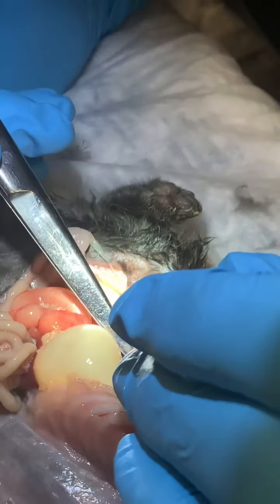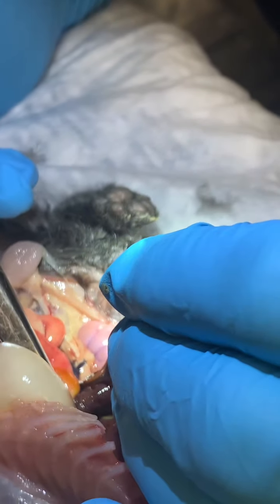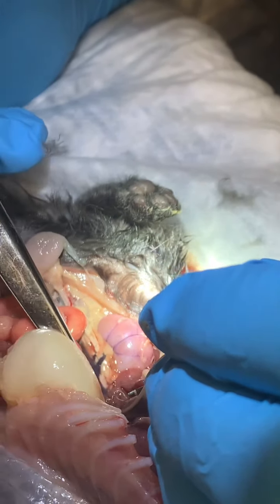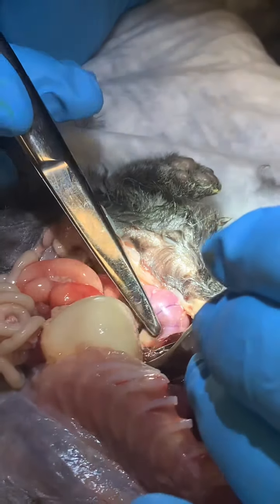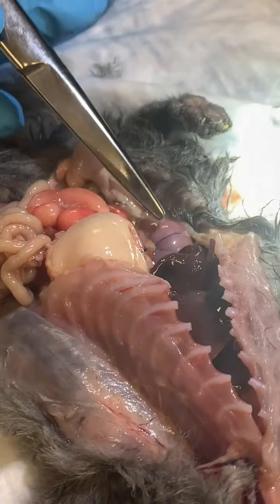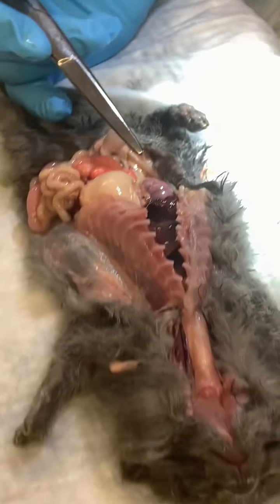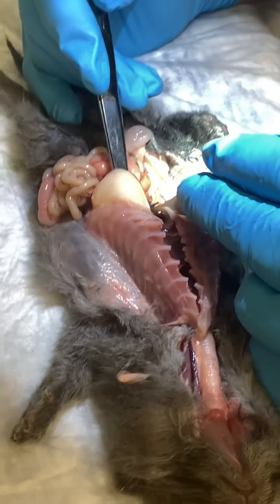Oh, I think that's it right there. That's it. The adrenal gland's right there. Gosh, no wonder you can't ever see the darn thing. Yeah. And its consistency is like the pancreas, and the adrenal glands are really not very dense. So they're hard to see with the ultrasound, but I think that's it.